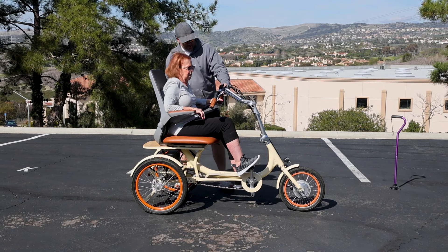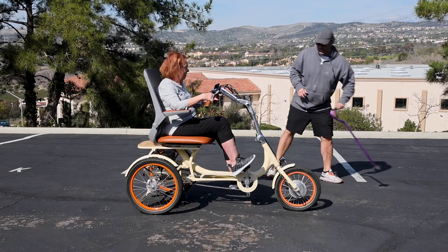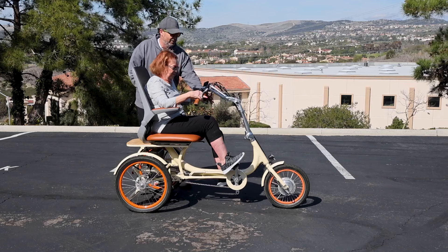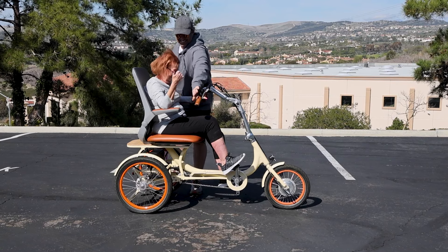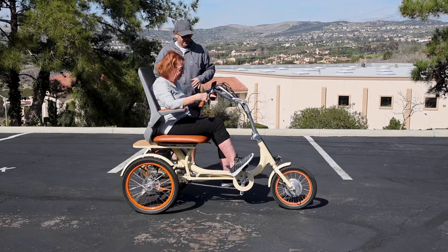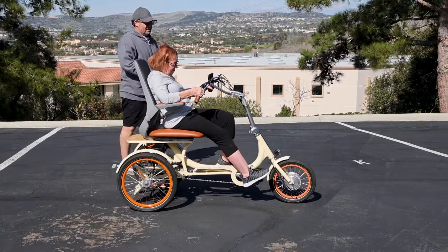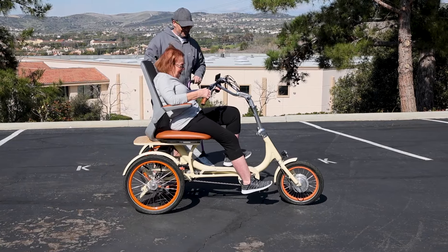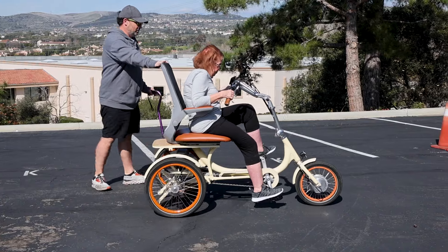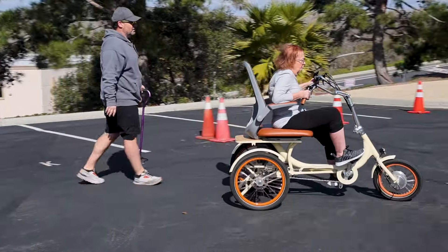She's going to show how she rides. I've put it in pedal assist one for her. Go ahead and pedal — oh, I had the parking brake on, sorry. There we go, now you're off and running. Once she gets that pedal rotation going she's going to feel the assistance. That's why we need the seat to move forward a little bit, which we'll work on.